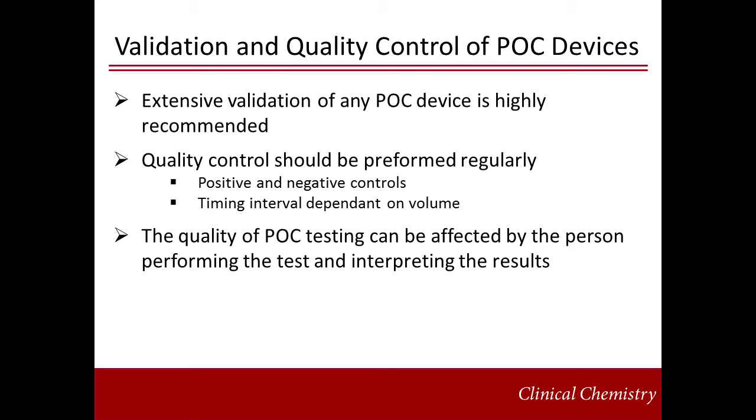In addition, quality control should be run regularly to maintain competency in the staff and to assure that the devices are performing accurately. Timing intervals for QC will vary based on assay and volume. It is also noteworthy to be reminded the results of the POC tests are highly dependent on the person performing and analyzing the results. This can add additional bias to the results that may not have been observed in the analytical validation.